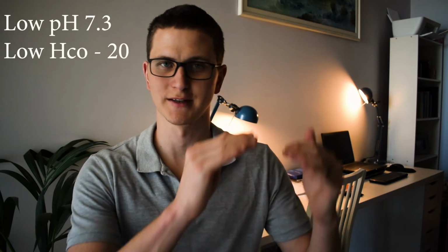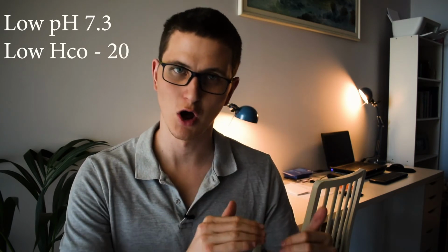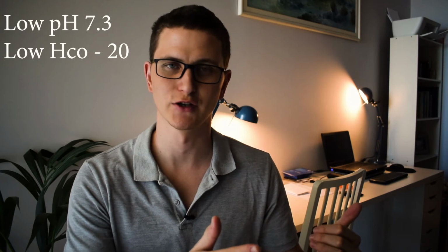So then you have metabolic equal, the other part of ROME, which means that if your pH drops below 7.35, you have an acidosis. But if your bicarb drops at the same level, so they're both low, your bicarb is less than 22, you have a metabolic acidosis. And if your pH is above 7.45 and your bicarb is above 27, you have a metabolic alkalosis. So those are ways to assess whether you have a metabolic or respiratory alkalosis or acidosis.